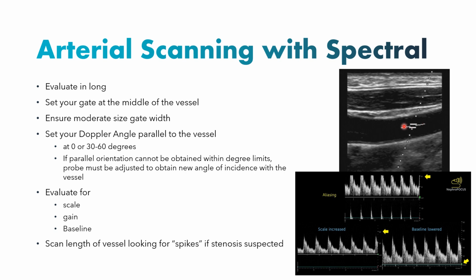Now, sometimes you'll find this challenging in that when you get your angle at 30 to 60, it can't be parallel with your vessel wall. And in that case, your only option is to actually change the angle of your hand. So maybe move your hand up and scan back to change the angle of that vessel across your screen. So be aware that that can be a challenge. And so, when you're working with the hands-on part, if you need support in being able to accomplish that, that's a great time to do it. If not, with a lot of practice, it becomes eventually natural.